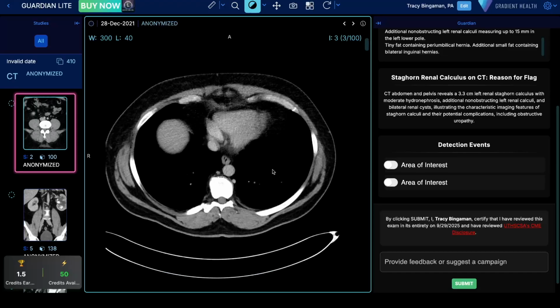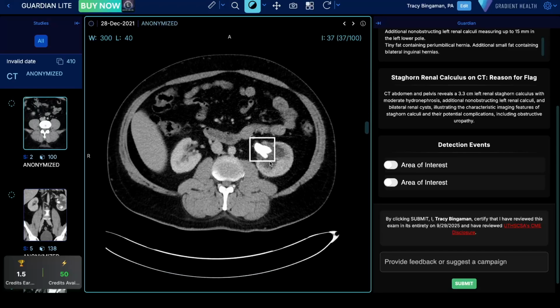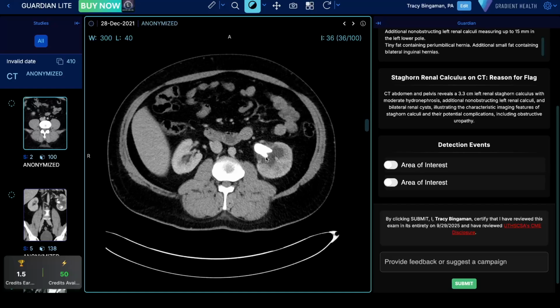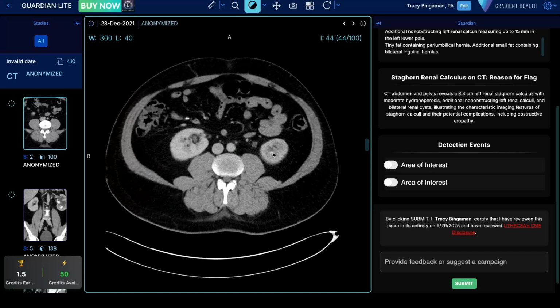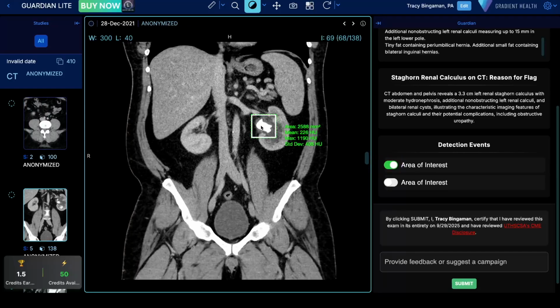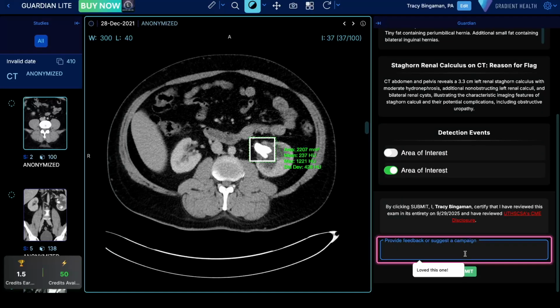We're going to scroll through on this other view and just say, hey, here's this hydro. All of this swelling you can see right up to the top of the kidney. Throughout, here's the start of that stone. Here's its largest view. And then you can see these stones in the lower renal pelvis. So just like we looked at, we can just confirm our own knowledge and ask it to toggle and show us: did we know where that stone was? Did we see this hydro? Did we identify these things correctly? And we did. And then we just feel confident in our ability to do that.